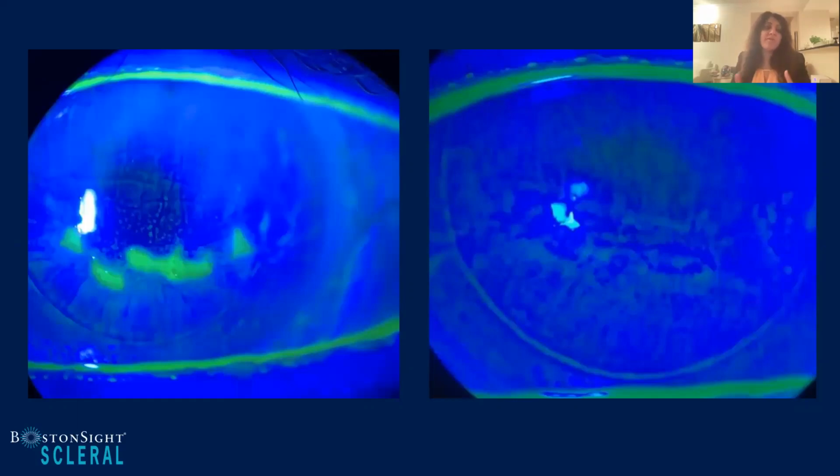They're seeing better than they did even with their initial lenses, because that nourishment of that fluid on the cornea just keeps healing the cornea and keeps healing it. And it's incredible what scleral lenses are able to do.